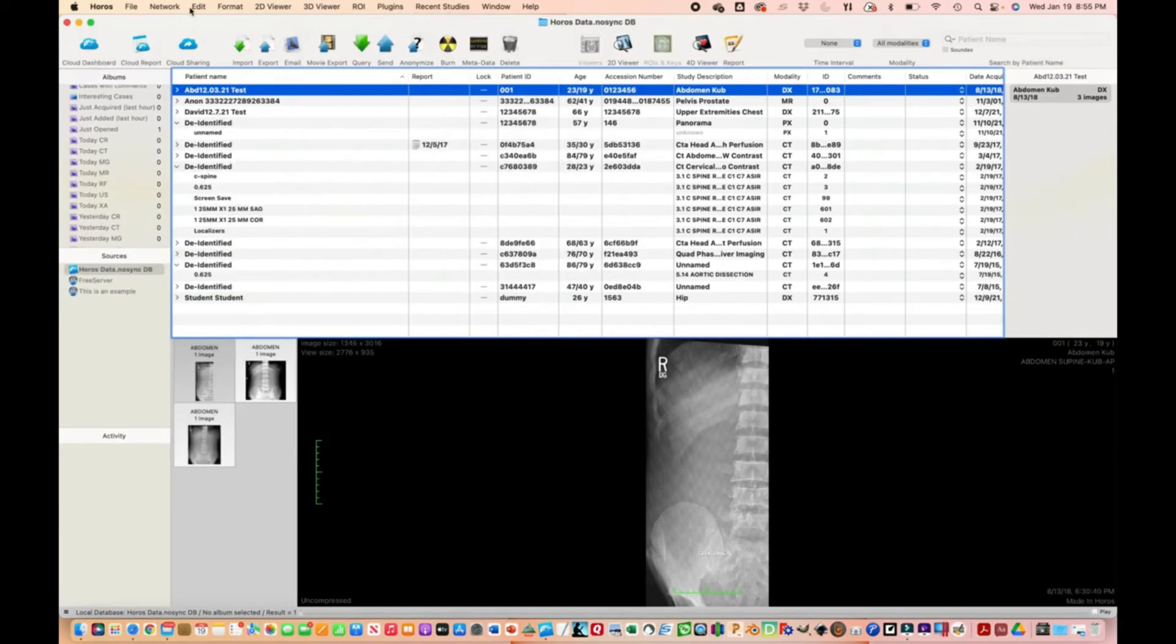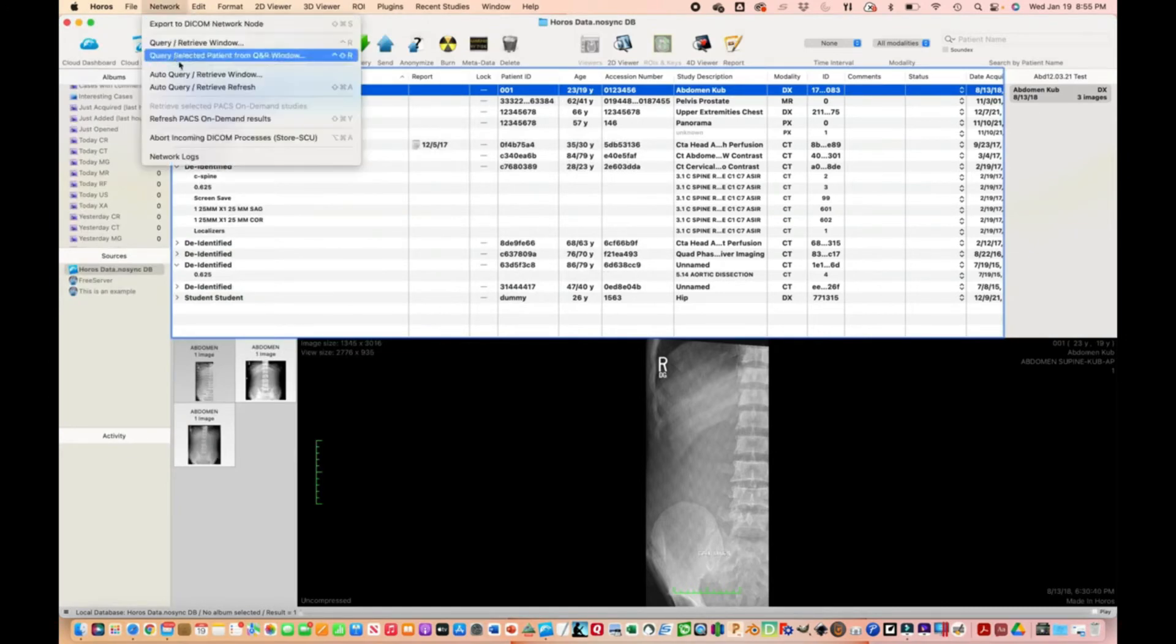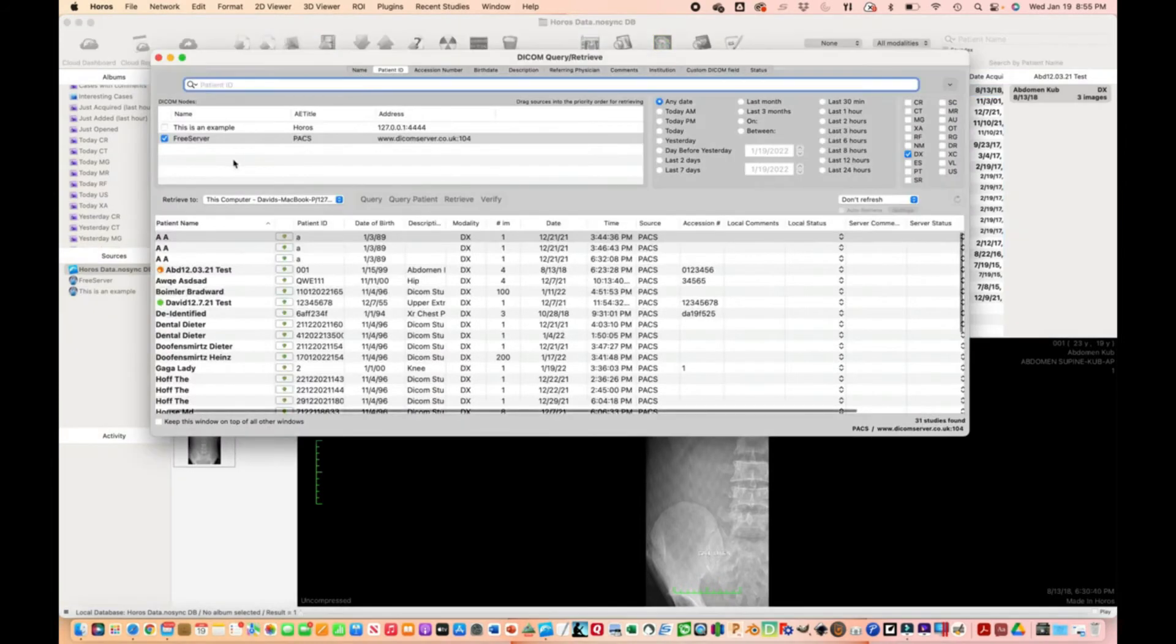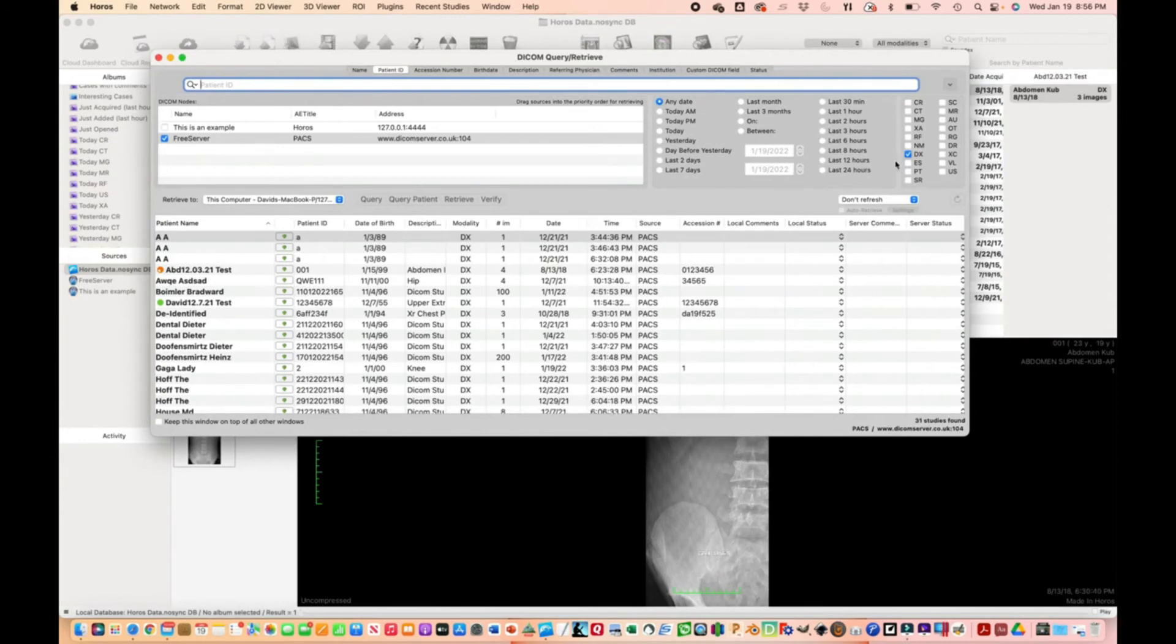When you go to Network and then Query/Retrieve window, that's populated by this server we set up. If you want to find digital images, select DX and hit Query.